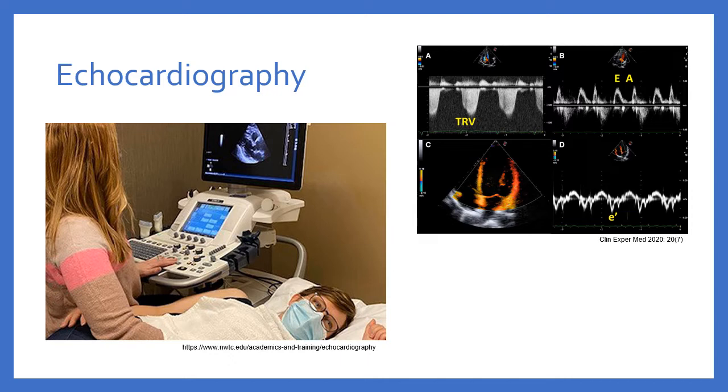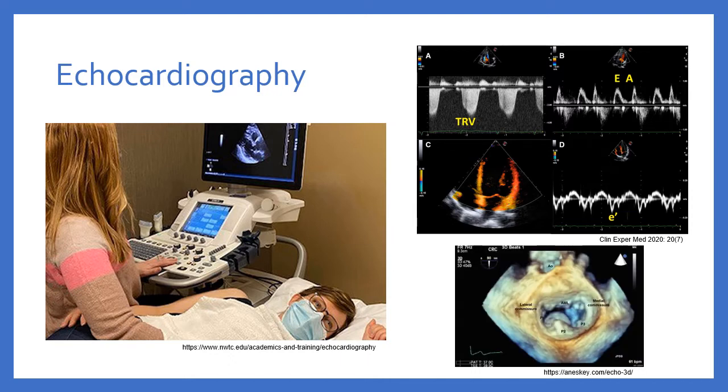They often use different types of Doppler modes to make diagnoses, and this allows them to look at a wide range of pathology in their patients. And then lastly, formal echocardiography is sometimes even using 3D echo, where they can specifically look at the mitral valve, let's say, and know exactly what's wrong with the patient.